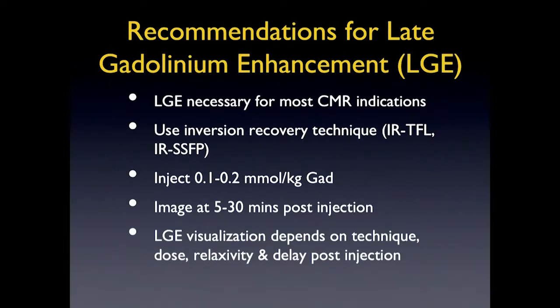And then late gadolinium enhancement visualization really depends on the technique, as I mentioned, and you use the IR-TFL, but this is somewhat simplified now because this technique uses PSIR. And really, there's not much dependency on the inversion time anymore. But also visualization depends on dose, relaxivity, and the delay post-injection.